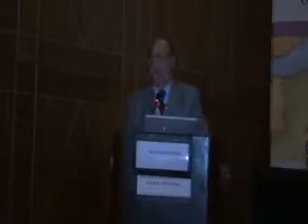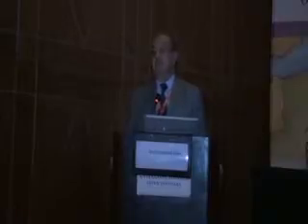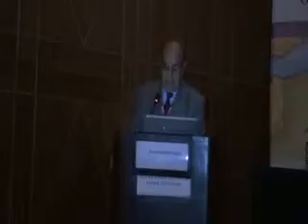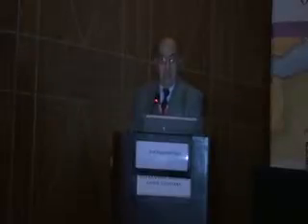a 0.35 Tesla MRI in order to see the position of the patients correctly. And this is in the market right now. It's called ViewRay, and this is one paper about ViewRay MRI adapted radiotherapy.